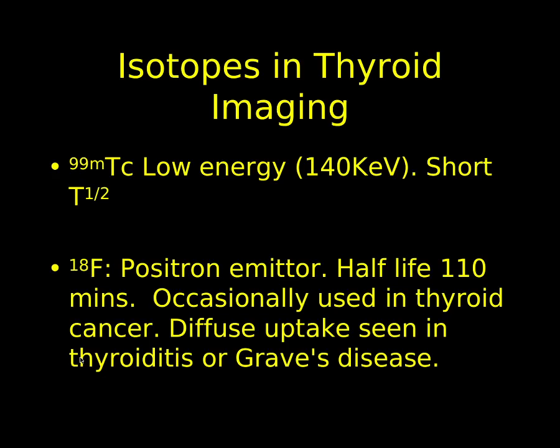So the form in which the technetium will be administered is technetium pertechnetate. That is the free or unbound form of technetium, which we will elute or draw off from the generator. That's what comes out of the molybdenum generator, which we will have in our radiopharmacy, which the vast majority of nuclear medicine departments will have. So if we want to do a thyroid scan, it's a readily available cheap tracer we can use any day. Whereas most departments, if they want to use iodine, they'll have to order it in.